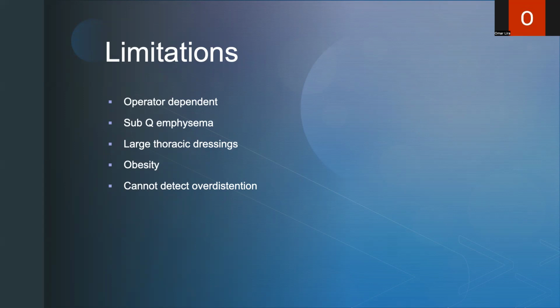And the biggest drawback is lung ultrasound cannot detect alveolar overdistension or hyperinflation. However, several studies are looking into this to hopefully someday figure out how to detect overdistension using lung ultrasound.